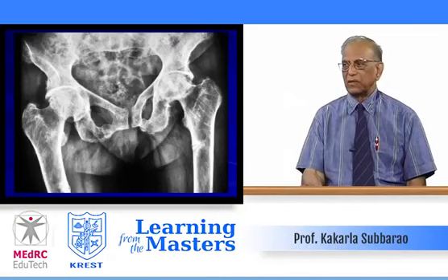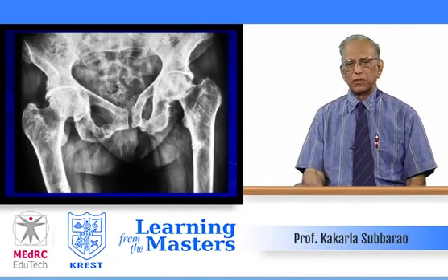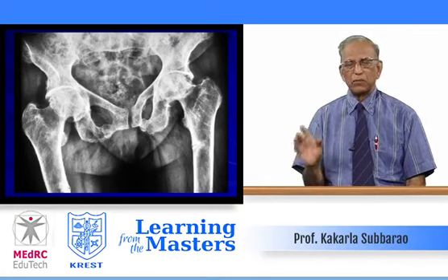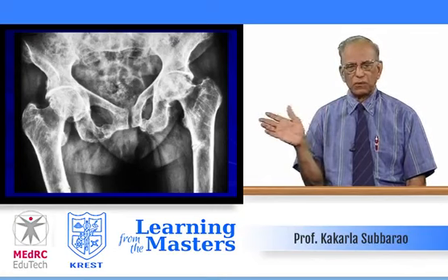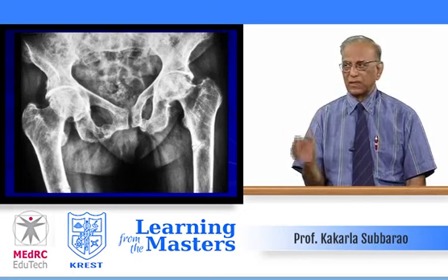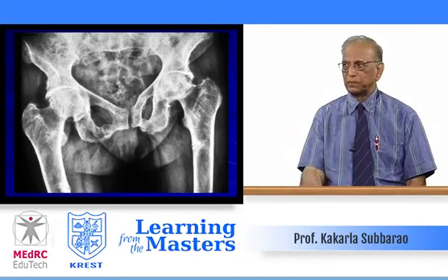Again, osteomalacia: lack of differentiation of the cortex and spongiosa. I am pumping this point in the youngsters because that is most important. Endosteal and periosteal new bone. That doesn't mean there is osteomyelitis or a real fracture. Real fractures can also occur with minor trauma, and secondary hyperparathyroidism.